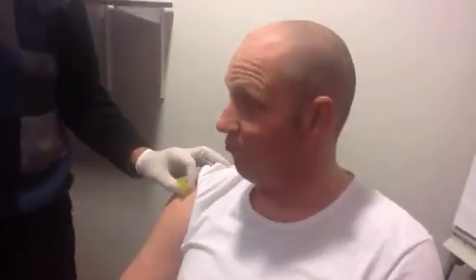One, two, three. Okay. You feel pressure, but... not too bad? What was the pain on a pain scale of one to ten? Two. Also a two, okay.